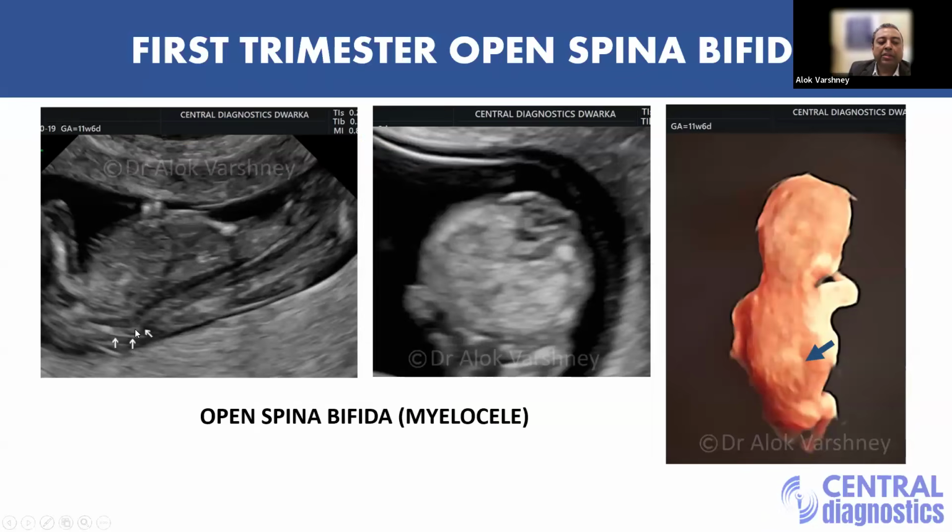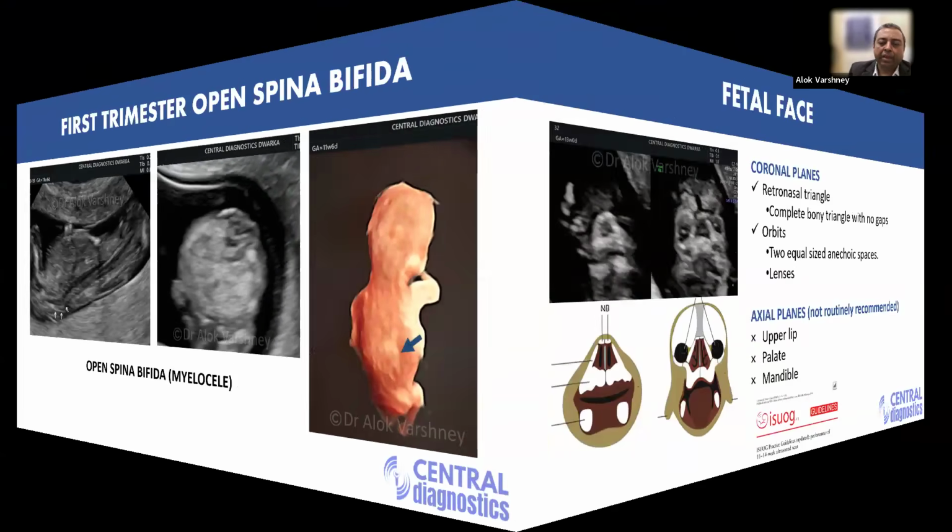And in many cases, we are going to find a defect such as this. So there's a curvature abnormality. We see there's a defect of the posterior elements over here. Now notice how subtle the defect is. It would otherwise be very difficult to pick up if we are just scanning the spine. But fortunately, we have intracranial signs which tell us that there's an open spina bifida.